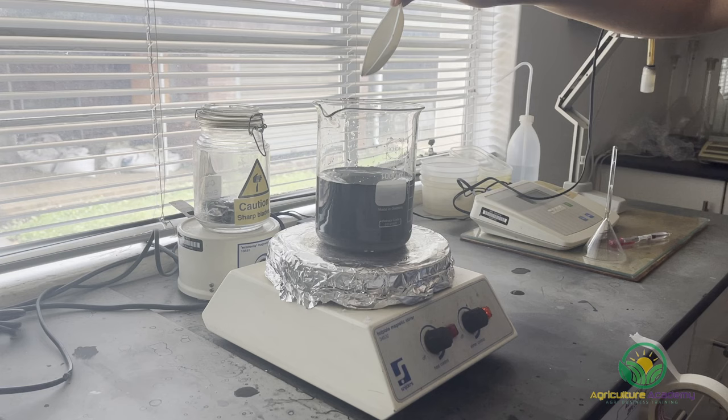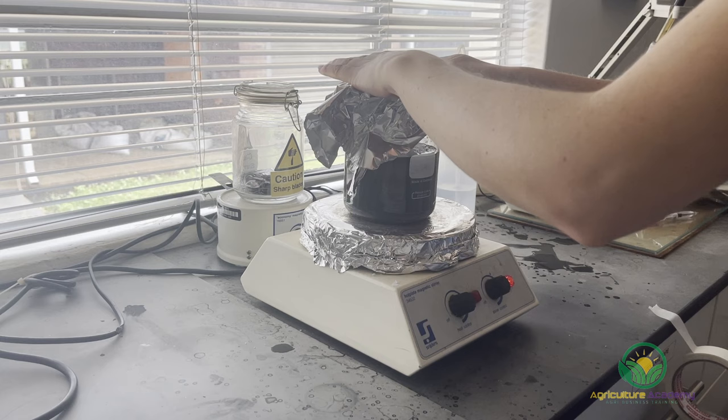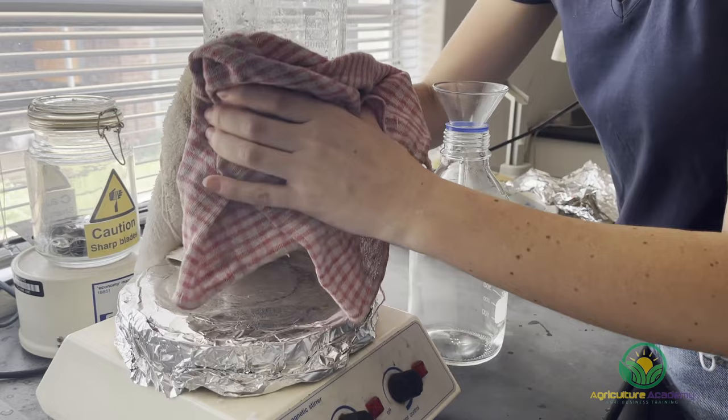A tinfoil lid was placed on the beaker to prevent evaporation and the solution was left to stir and heat up for 40 minutes to make sure everything was well dissolved and mixed. To make the pouring process easier, we transferred our hot, liquid solution to a glass bottle with a media dispenser attachment.